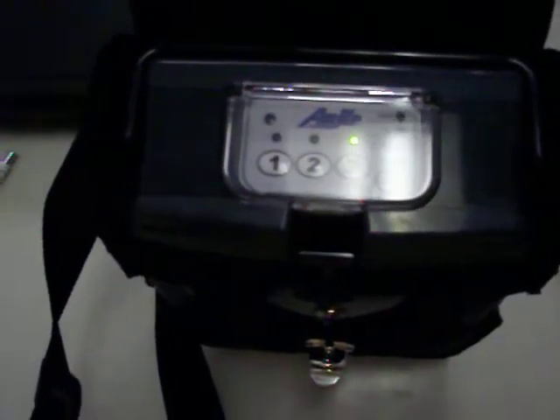This is the world's smallest portable concentrator. GoSouthernMD.com. If you've got any questions, you can contact us at 866-730-1910.